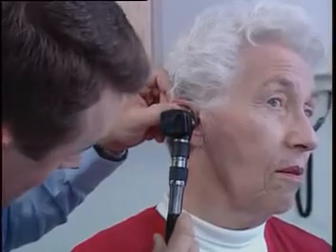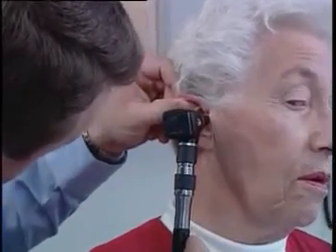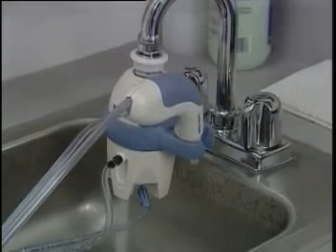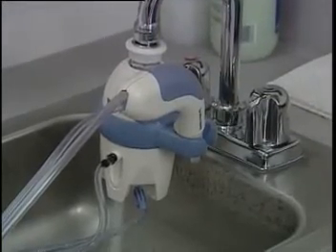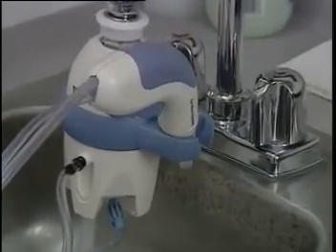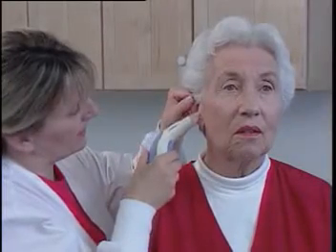You should periodically examine the patient with an otoscope during the irrigation procedure. While doing this examination, you can safely store the handle in the handle rest grip ring located on the side of the pressure chamber. Occasionally, check the transparent filter on the disposable ear tip to visualize the dislodged cerumen that you've collected.